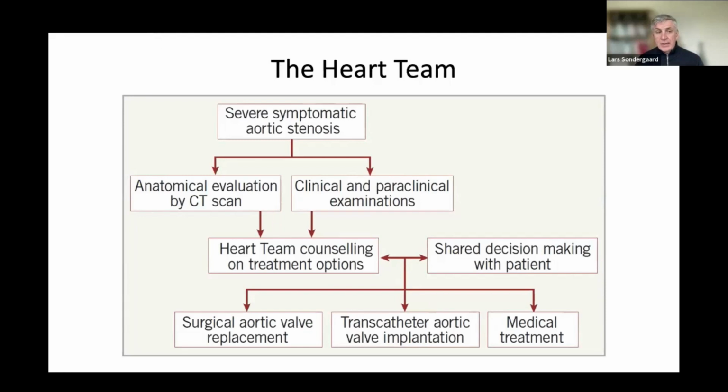One thing we're discussing now is what is the risk of patient-prosthesis mismatch? Should that change how the heart team is counseling the patient if there's a risk of PPM? We had the discussion a few years back with our surgeons, who were somewhat reluctant to do a CT scan on every patient. But since we started, they're very keen to have this information up front.